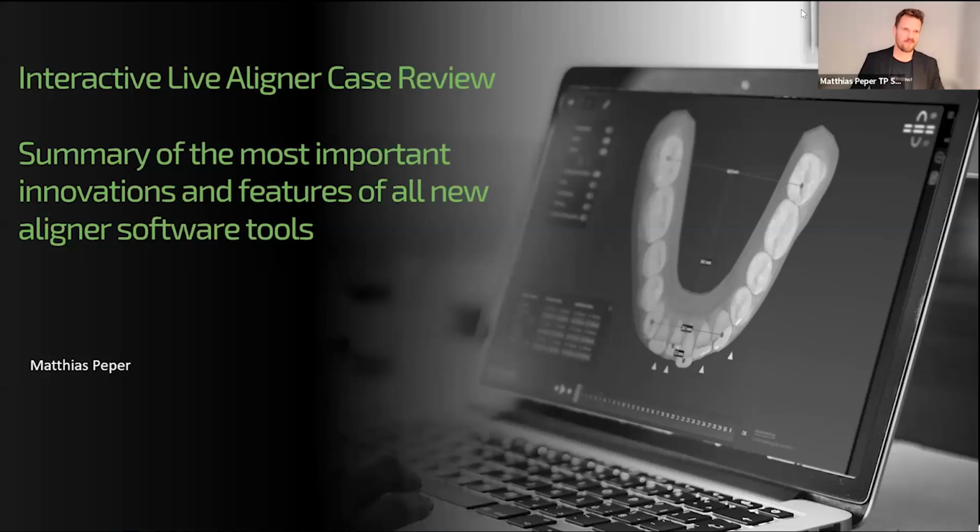For all of you, you've already been two weeks ago at the Prime Aligner Summit in Como. So we had a very interesting summary of the most important innovations and features of all new aligner software tools. And we received a lot of feedback regarding this topic, and a lot of questions. Most of the doctors were asking, can we talk a little bit more about these features, about what are the newest innovations in the different software? Let's try to dive a little bit deeper.